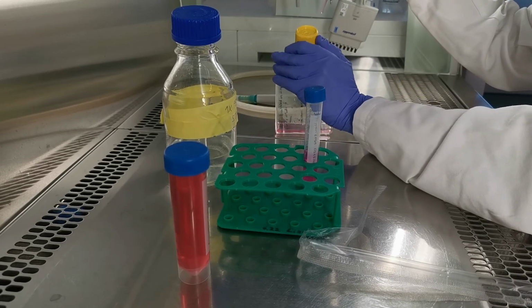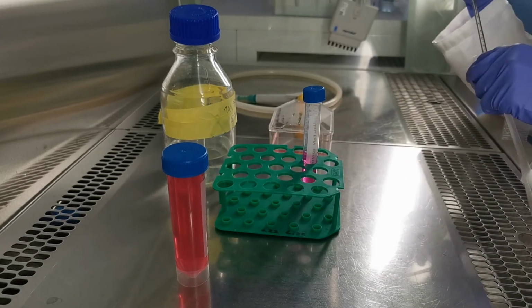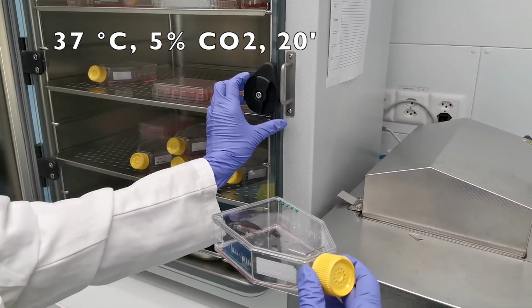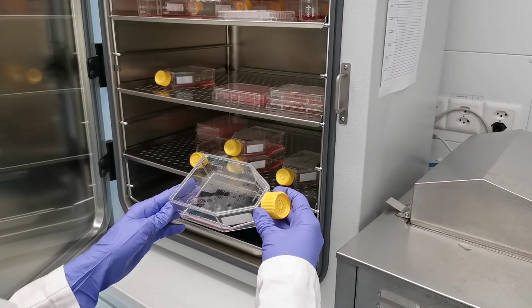The trypsin will be evenly distributed across the flask, and then the flask will be brought to the incubator, which is at 37 degrees centigrade with 5% CO2, and there the 20-minute incubation will begin.